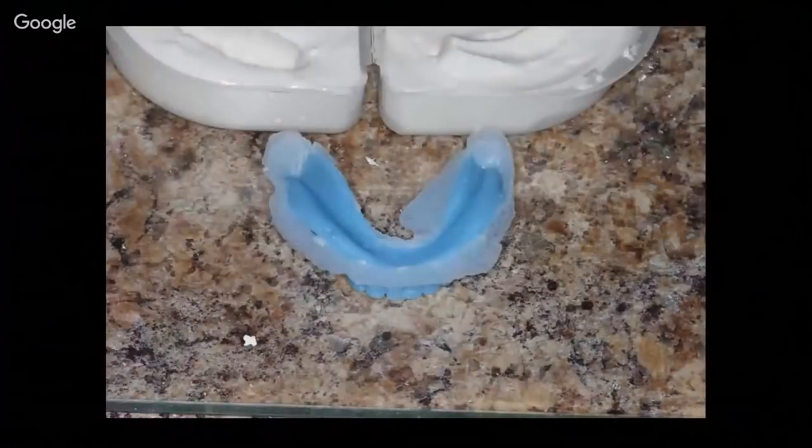So what I used to do for expediting this whole denture process, because again, prior to the digital denture options, I still had all the same denture dilemma that I went over initially. And so we were trying to take great efforts to really expedite the fabrication of complete dentures. One of the ways I found to do that was in using duplicate dentures. So we would duplicate the patient's denture chair side. This was typically the first time that we had ever seen them. We would duplicate that denture chair side and then use that as our impression tray.